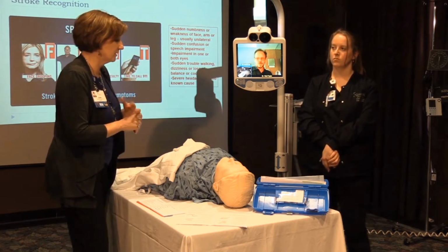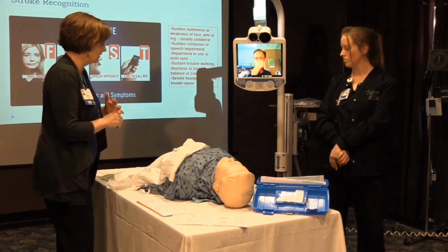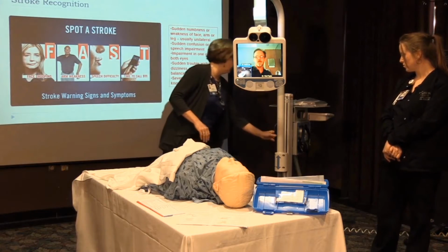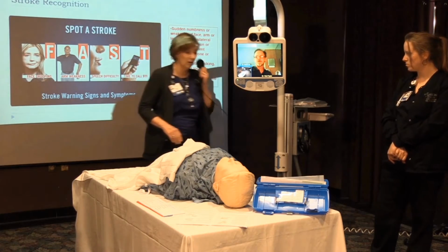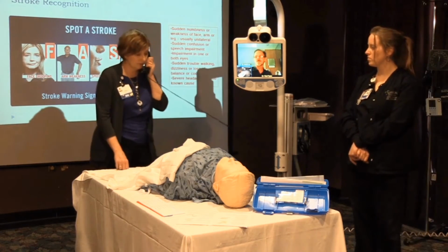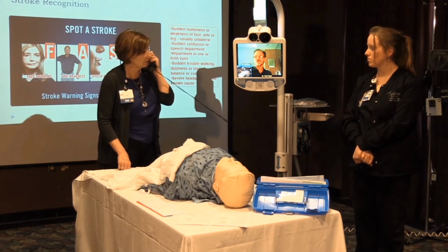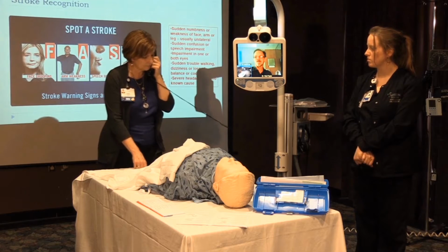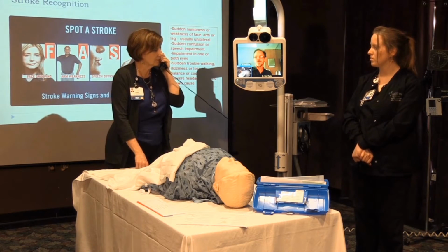Secondly, there is also a handset on this cart, and I just want to check it really quick, Dr. Taylor, to see if it actually connects with where you are. Can you hear me now? Dr. Taylor? Let me see if I can fix it. Yes, I can.